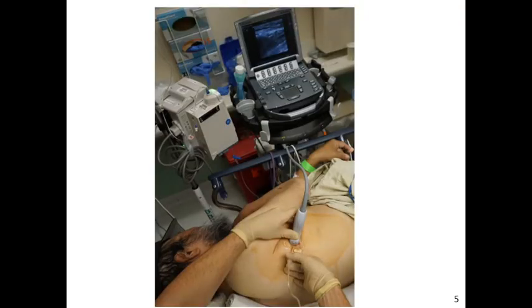Once all of the important anatomy has been identified, you can set up to perform the nerve block procedure. The ideal positioning for this block is for the patient to be placed in the lateral decubitus with the affected side facing up. The probe can be rotated such that the rib is in the long axis, as the probe orientation is shown here in this photograph. This provides a backstop to prevent the needle tip from entering the pleural space.